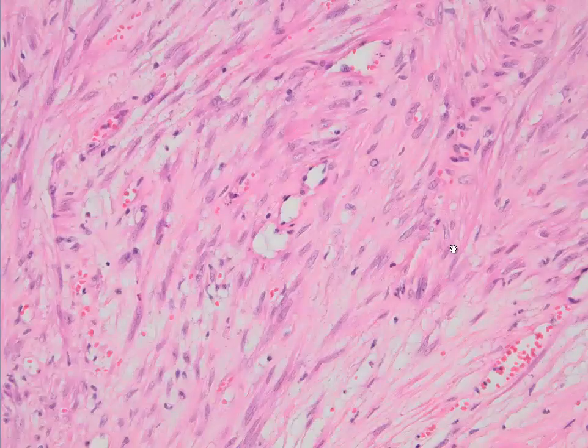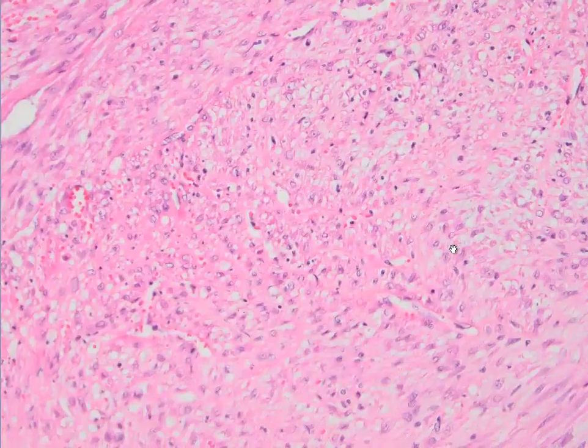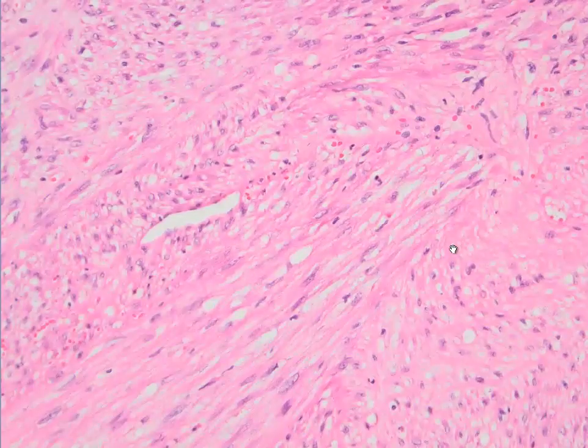Again we have this very nice spindling myofibroblastic cells accompanied by quite a number of inflammatory cells, and again cytokeratin was positive, not that diffuse, but we have this focal cytokeratin staining in this example of IMT, and in the biopsy it was more prominent. As you see here in the biopsy of this case, cytokeratin was more evident.